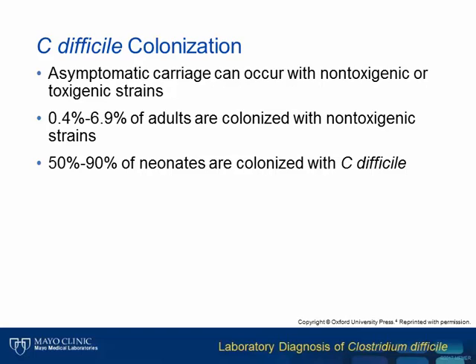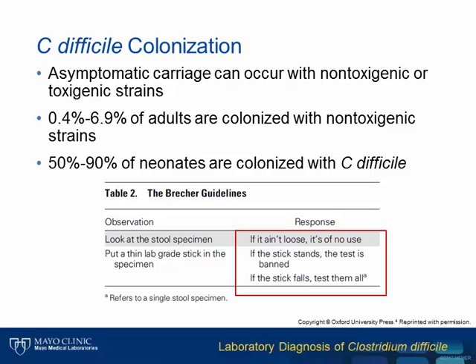Infant intestinal cells do not appear to have receptors for toxins A and B. Therefore, a much higher percentage of neonates may have detectable C. difficile in their stools, but do not manifest with disease. Therefore, only unformed stools should be tested when assessing infection due to C. difficile. Dr. Stephen Brecker coined CDI submission guidelines for stools shown in the table. Formed stools may be tested, however, in cases of ileus or toxic megacolon when stool is often not passed.